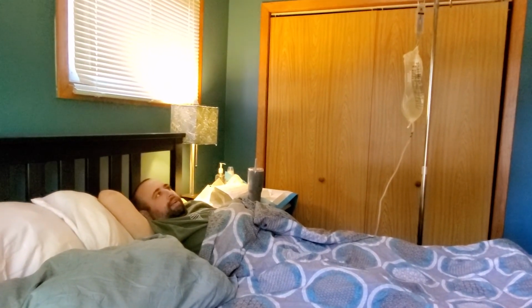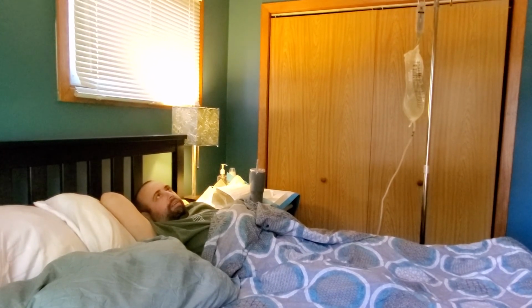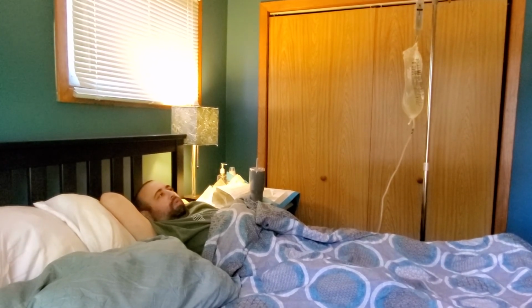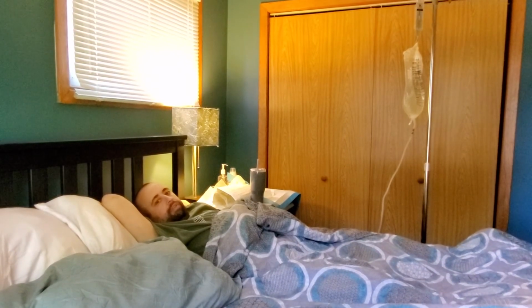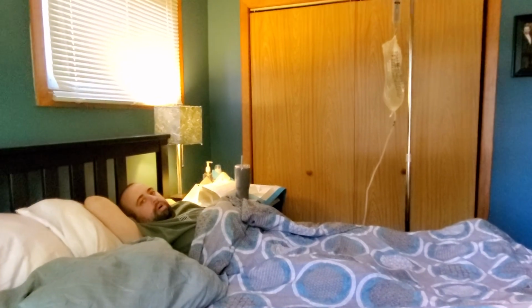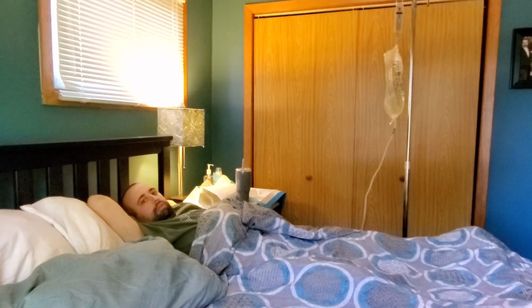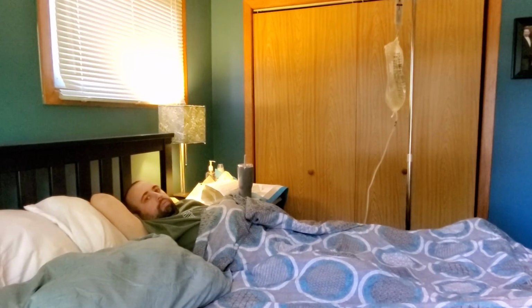The other thing we forgot today was to check my temperature, weight, and blood pressure before we started. So we'll have to do that after the first cycle. But every day I need to check those and record them as that gets sent over to my nurse. And then that tells you how much or what kind of solution.